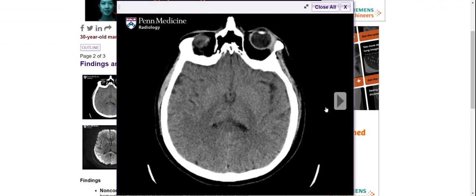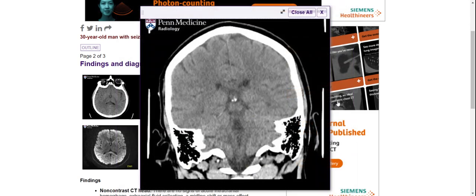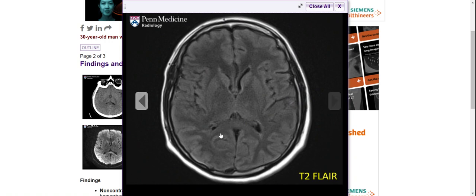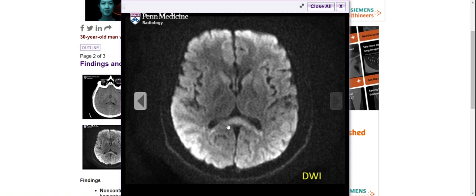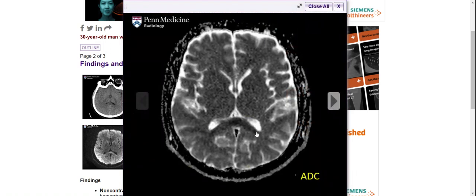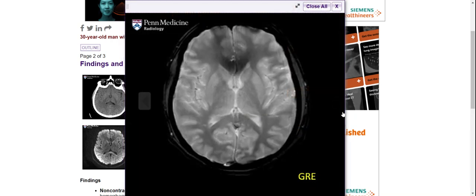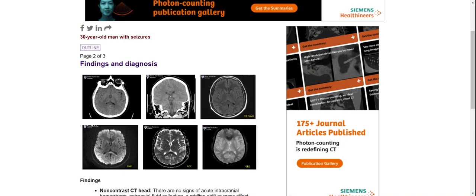So let us go through the images again. On the axial and coronal planes, we see the splenium shaped like a boomerang. On DWI, there is hyperintensity. There is also a little bit of edema and hyperintensity of the splenium.